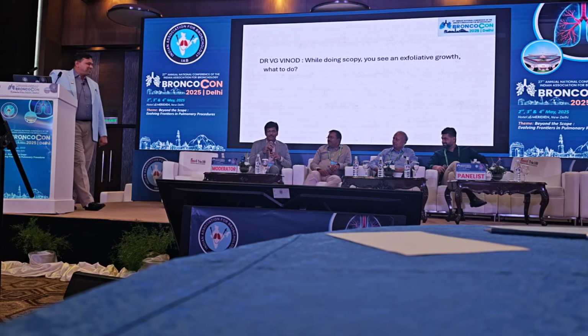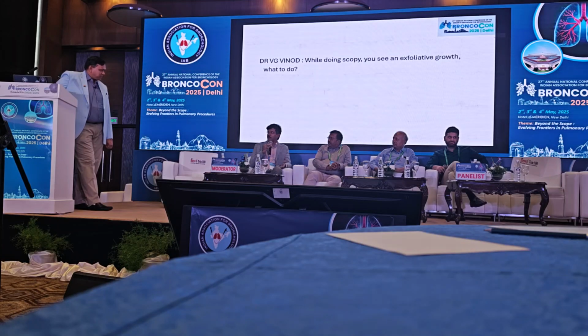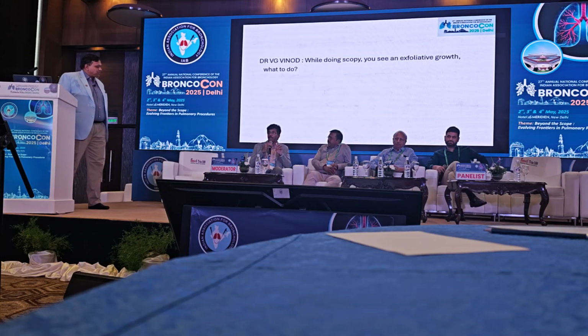Yes, so this has changed over time. In the last 10 years, when I was learning, with any growth we would try to jump at it. Now, after encountering a few patients, when we are not planned, the first thing with any growth, malignancy suspicion or mass lesion is that we need to plan. I'll give a scenario: we had a patient, we went in and encountered a large left main bronchus tumor. We were enthusiastic, we took out even with a flexible scope under local anesthesia. But we ended up having the tumor fall on the other side, where the patient had residual tumor in the left main bronchus and a complete block on the right. We somehow took it out. By the time, the patient arrested, the anesthetist came, code blue was called, and intubation was required on the table.